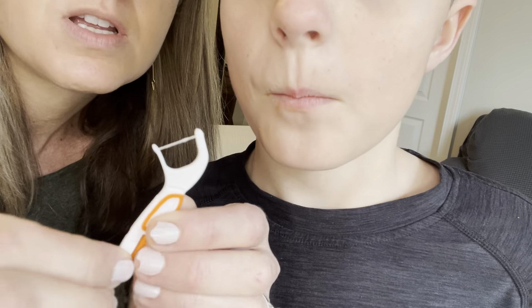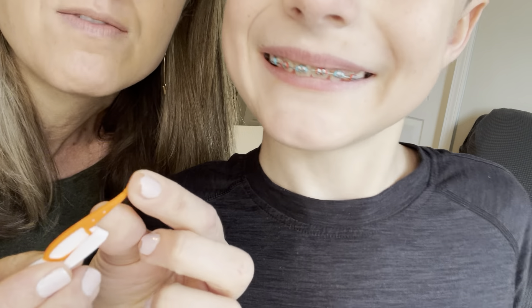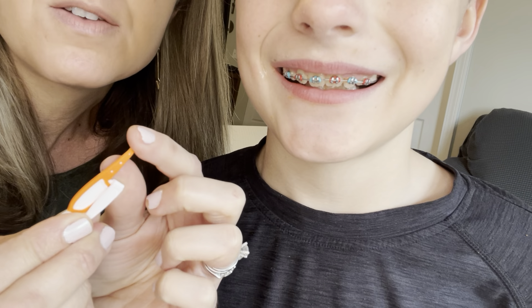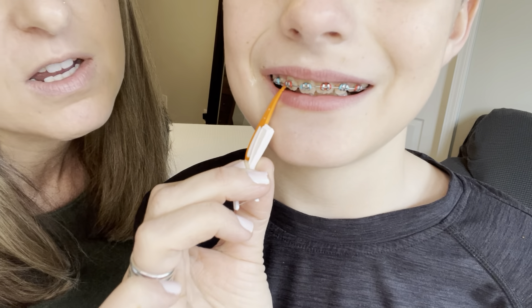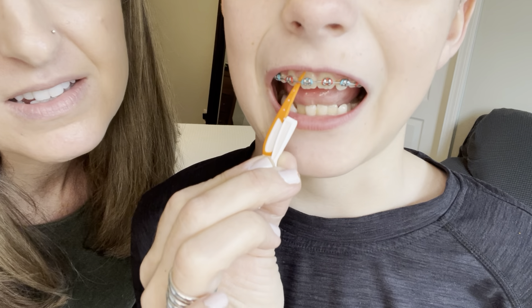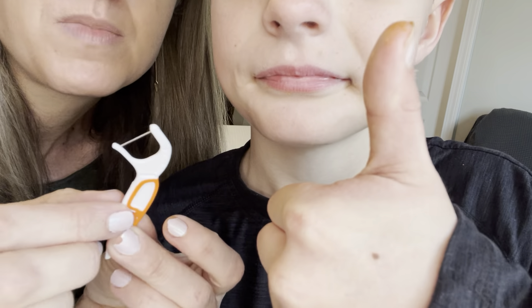Just to note, you could bend this out of the way and use this little part — it feels kind of like silicone. It is flexible, and you could use this if you had food stuck in your teeth. You could stick it up through the wires and release all that yuckiness. So these are fantastic flossers for braces wearers.